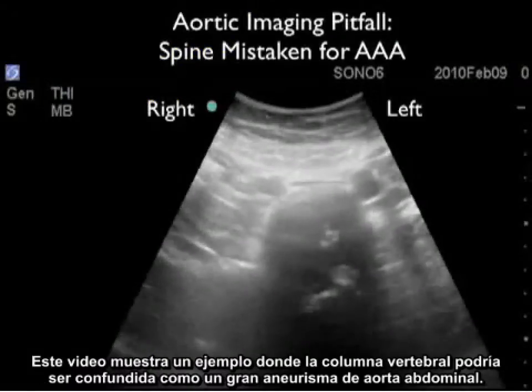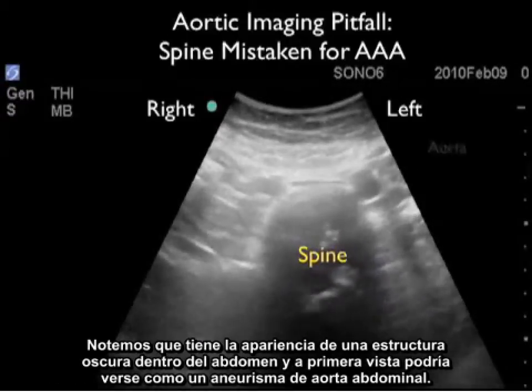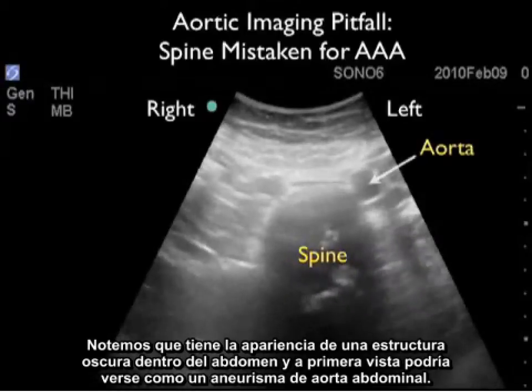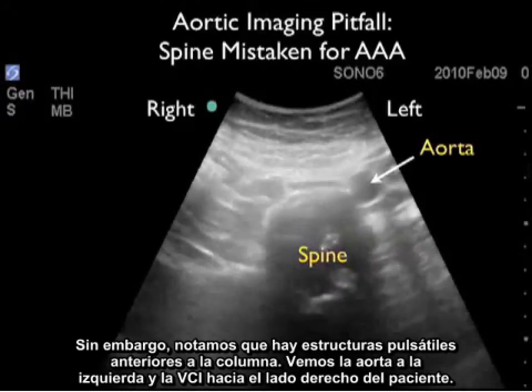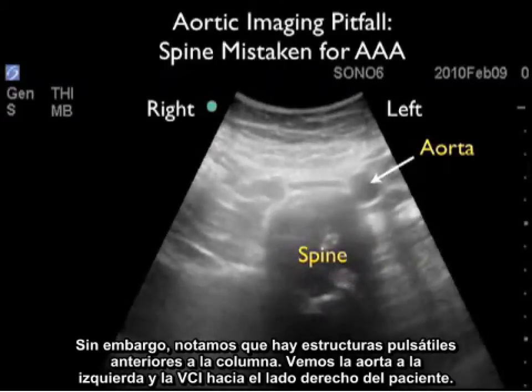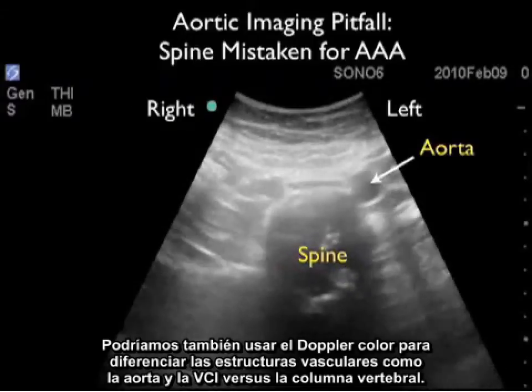This video clip shows an example where the spine could be mistaken for a large AAA. It has the appearance of a dark structure within the abdomen that at first glance could look like an AAA. However, note the pulsatile structures anterior to the spine — the aorta to the left and the IVC towards the patient's right. Color power Doppler can also differentiate the vascular structures of the aorta and IVC from the spine.